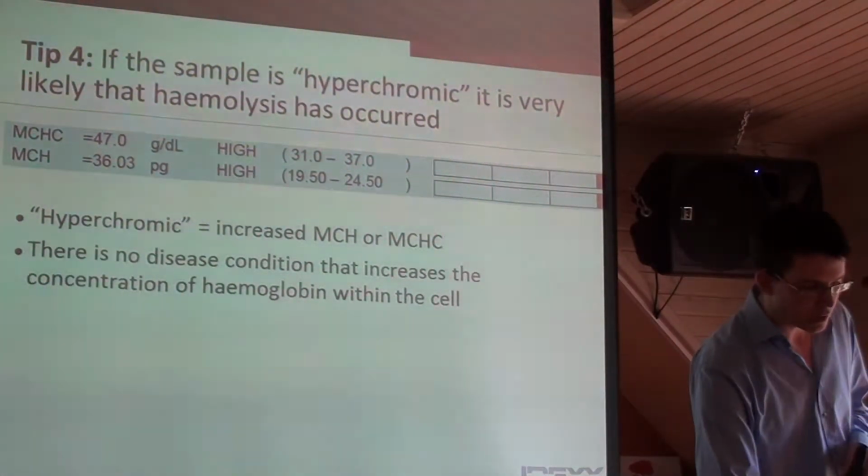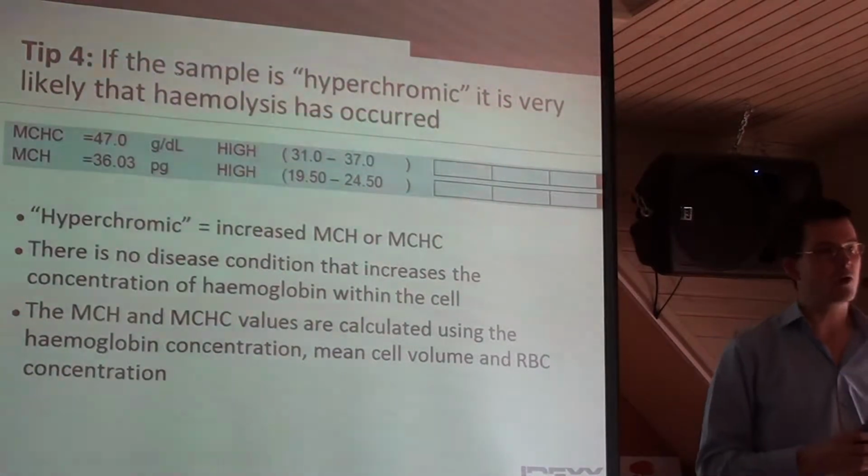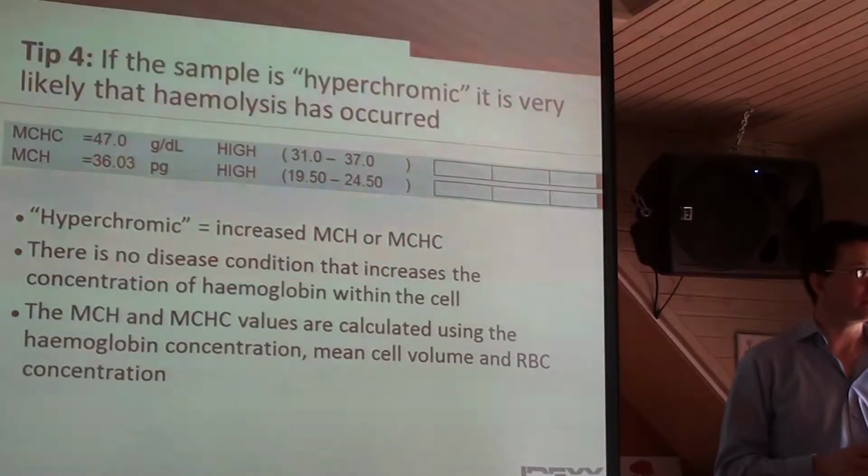So to understand that, we must appreciate how those parameters are calculated by the analyzer.